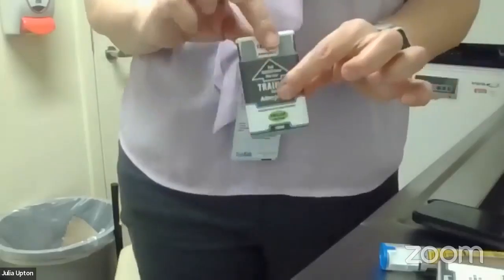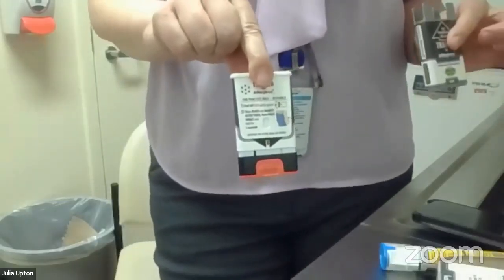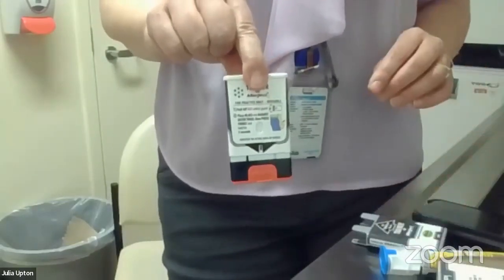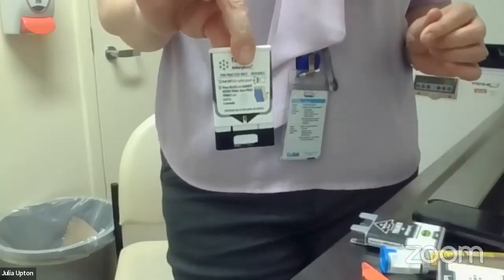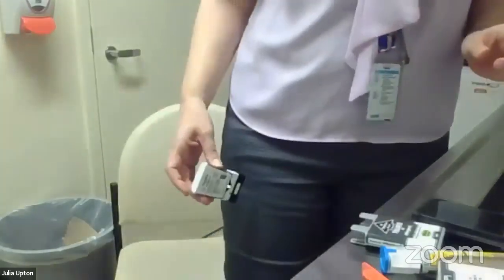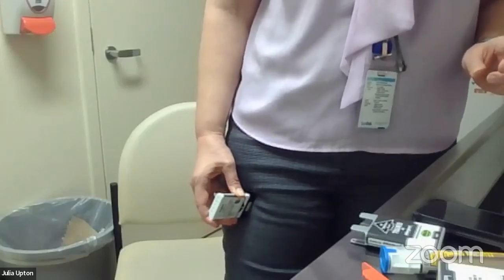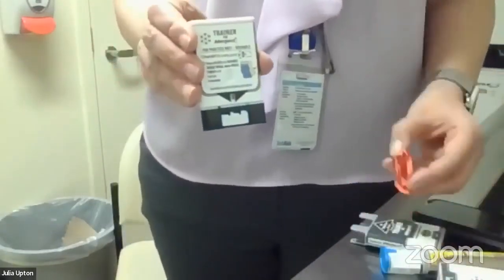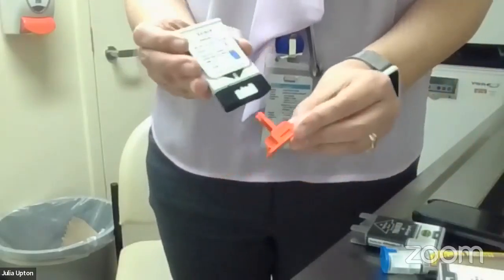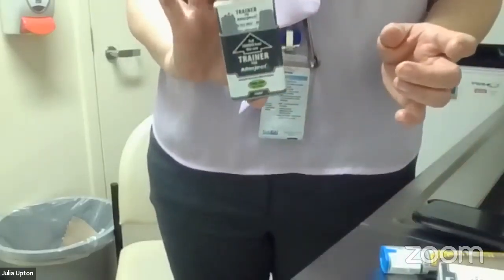This one talks, so I'm going to let this one do the talking for me. This contains no needle or drug. If you are ready to use, pull safety guard. To inject, place black end against outer thigh firmly and hold in place for 5 seconds. 5, 4, 3, 2, 1. Injection complete. This trainer may be reused for training purposes. Place the red safety guard and gray.